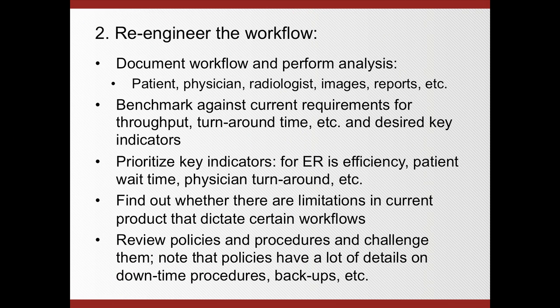The second item, which is important as well, is re-engineering the workflow. If this was your first PACS system, you might have done some initial workflow assessment and re-engineering. However, if you are not too familiar, and in many cases you weren't, if you're not too familiar with how a PACS system would operate, it is really hard to re-engineer a system if you don't know really how the ultimate operation could be.